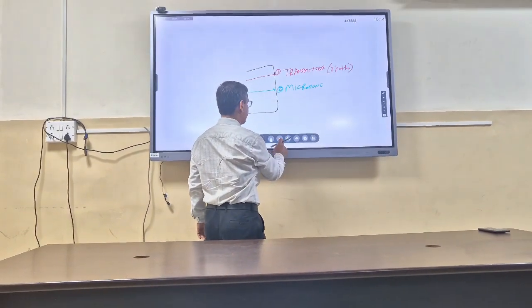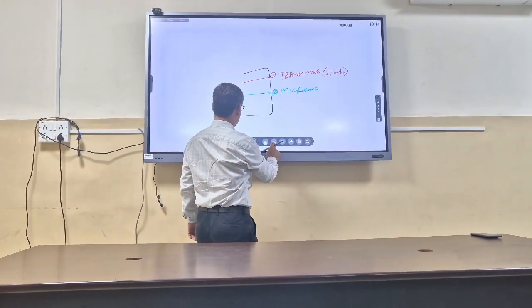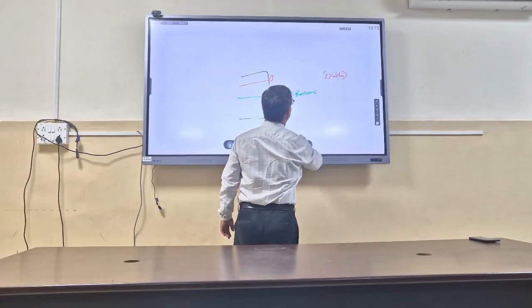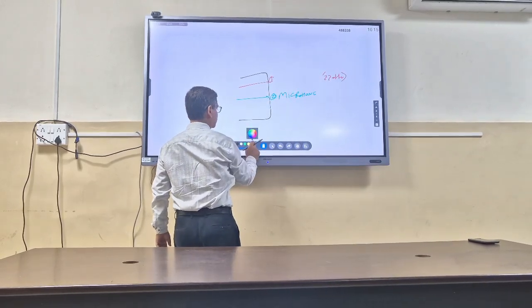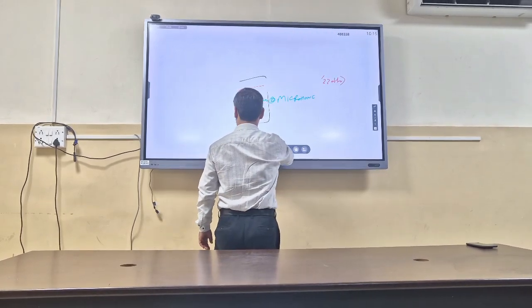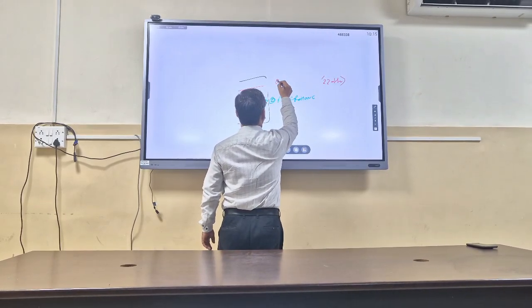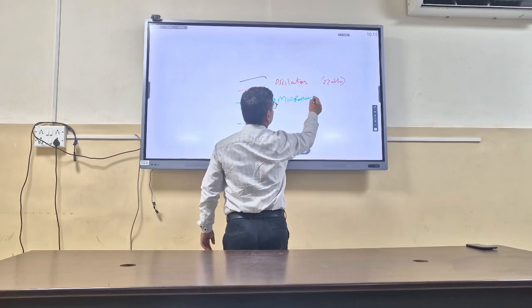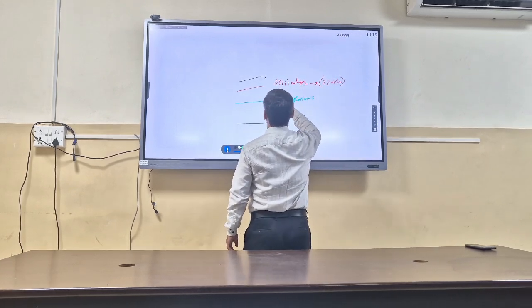Let's use that term only. This is the oscillator, which delivers a sound of 220 Hertz.